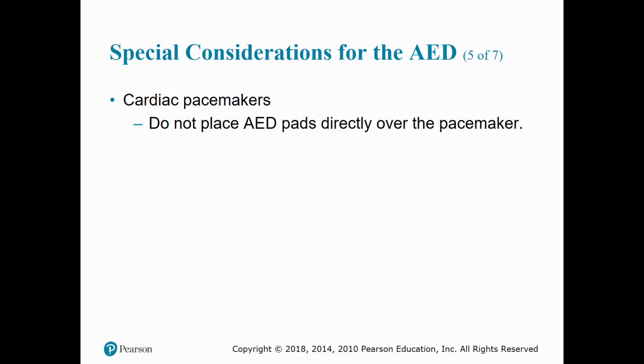Do not place AED pads directly over a pacemaker. Normally a little lump can be felt in the chest. Very important: if you do feel a little lump under the skin, it may be a pacemaker, so be careful not to place the AED pads directly over it.